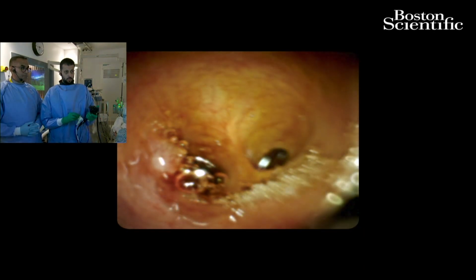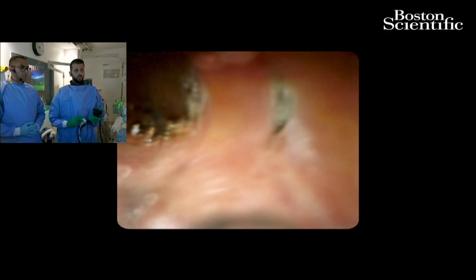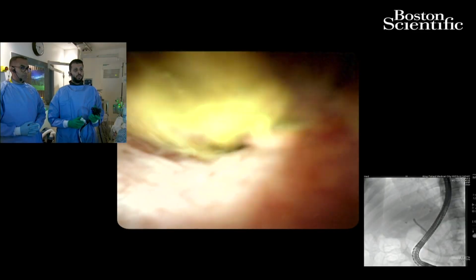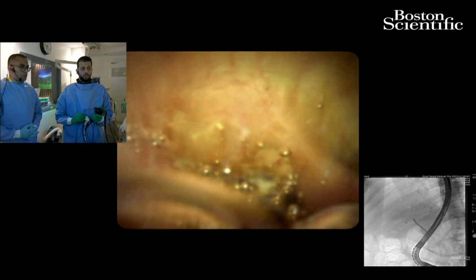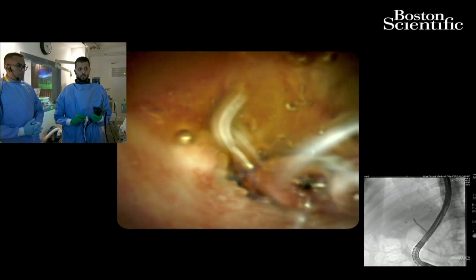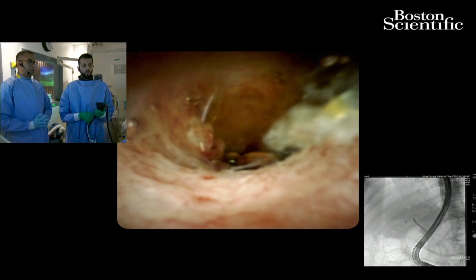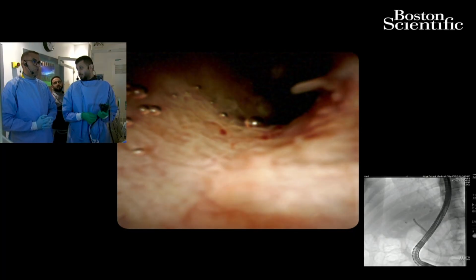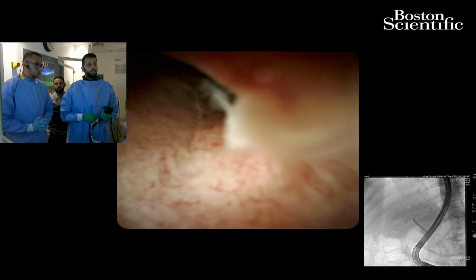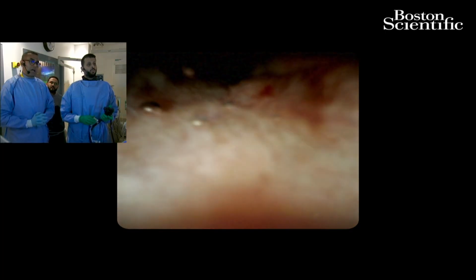My question for the audience: is it normal to use a spyglass in a case like that? If you have a case like that, do you use a spyglass, or do you remove the metallic stent and put in a plastic stent if it's something in the mid-common bile duct, because spyglass is very expensive? In a case like that, if it's absolutely benign, basically the best approach is that you may choose not to use the spyglass in the index ERCP procedure.